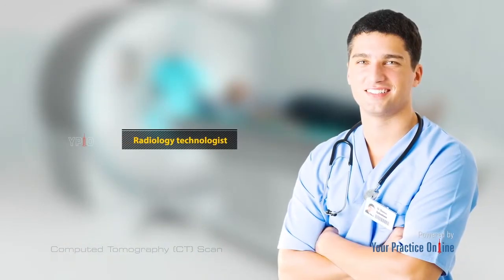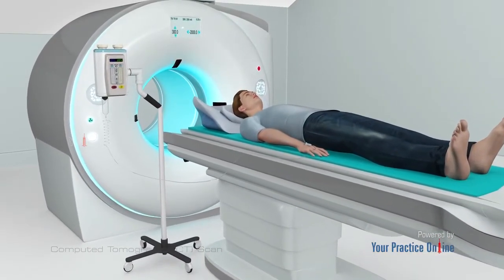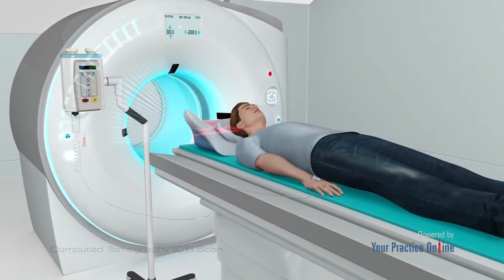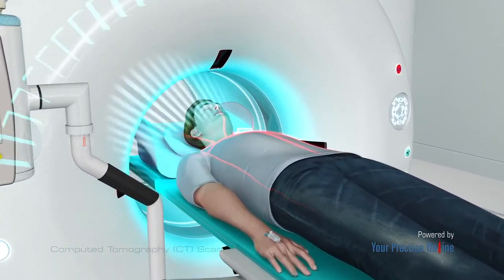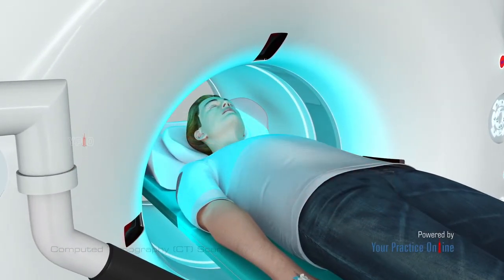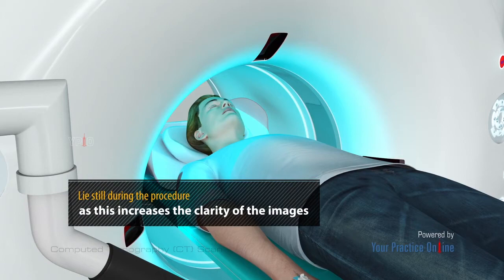Procedure: A CT scan is usually done by a radiology technologist. You will lie on a table that is attached to the CT scanner. The table will slide into a large donut-shaped machine which takes images while moving around your body. Each rotation will yield several thin-sliced images of your body. You may be asked to breathe or hold your breath during the chest and abdomen scanning.